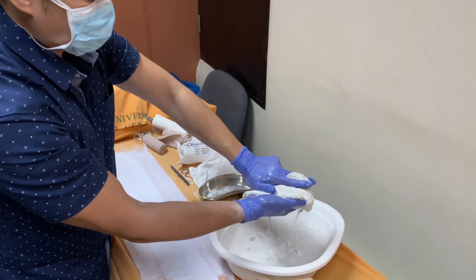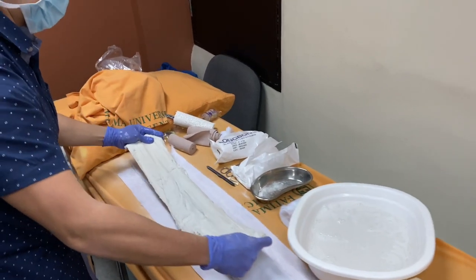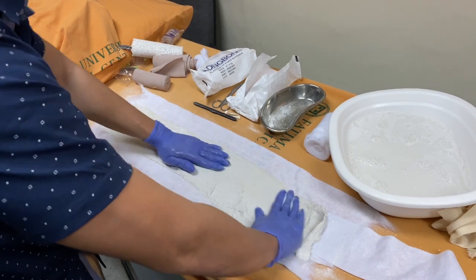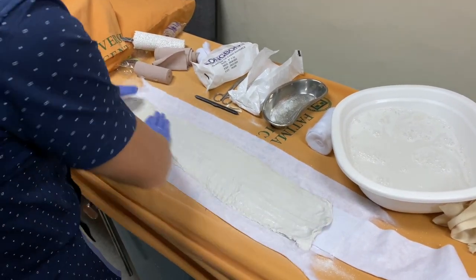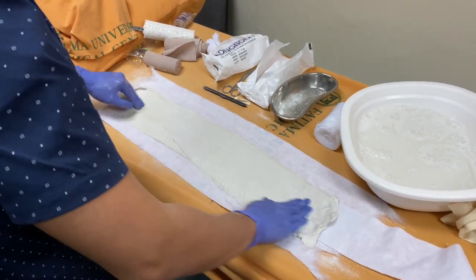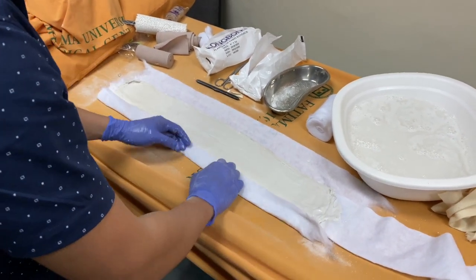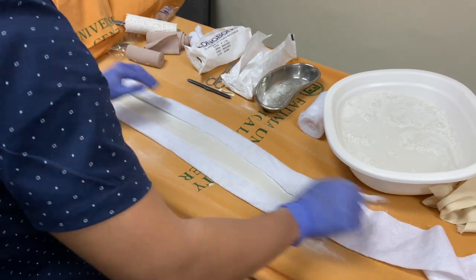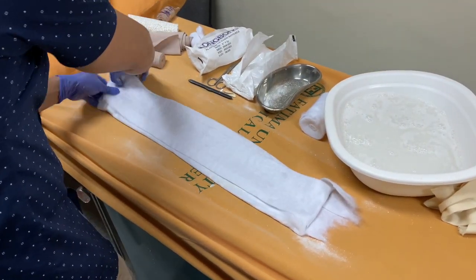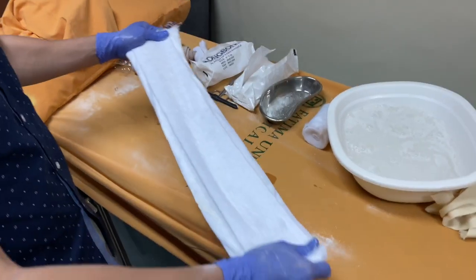Remove a little bit of the excess water so it's not too wet, then lay it down on the padding we made. Remove any air pockets because those air pockets will weaken the mold. Note that it shortened a little bit when it got wet. Then fold the two sides over — that's the padding layer on that area.